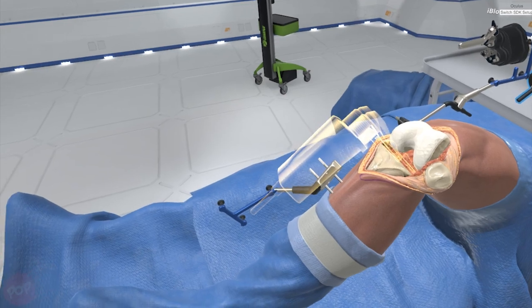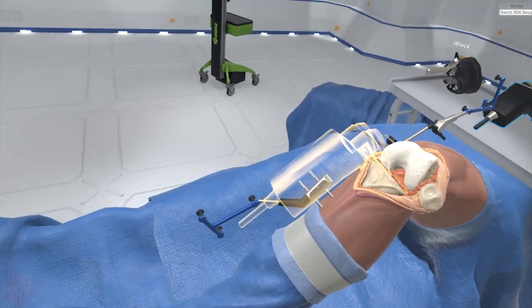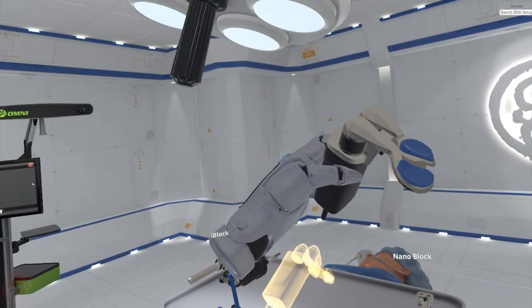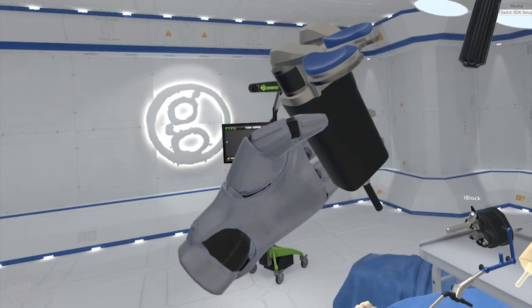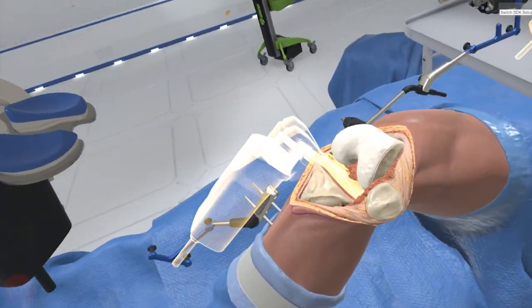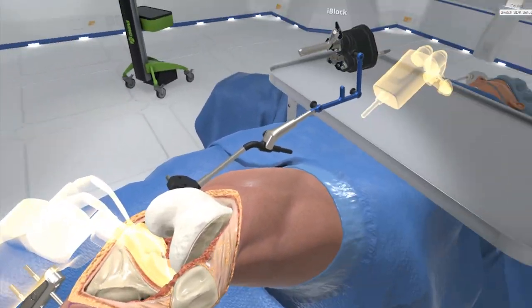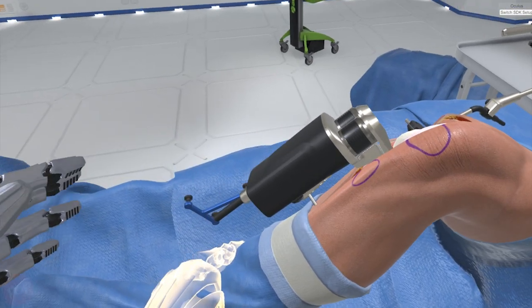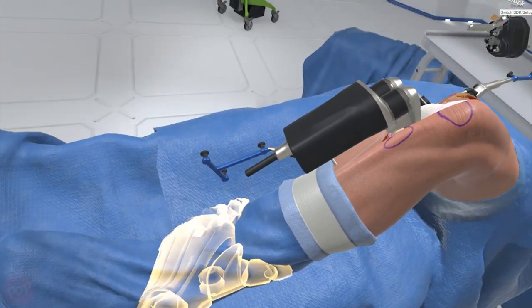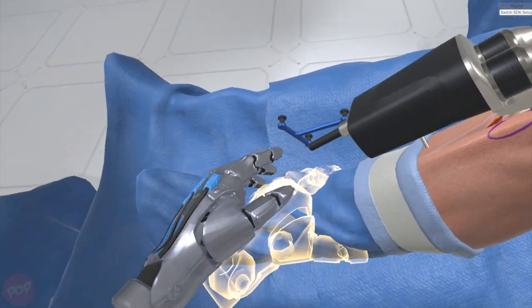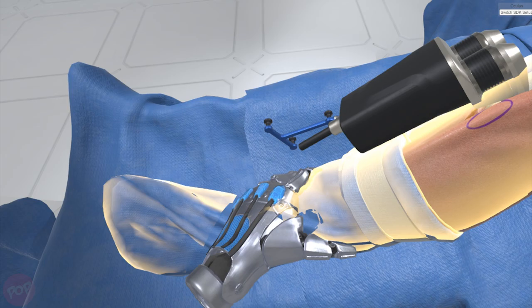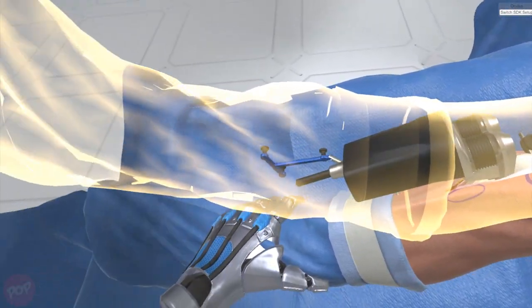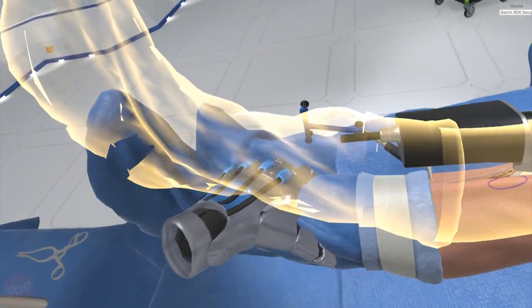Select the balance bot. Install it by inserting the robotic paddles into the joint space on the resected tibia. Grasp the ankle and manipulate the leg into full extension and back into roughly 90 degrees. Maneuver the leg through a complete range of motion to get quantitative data on the knee.